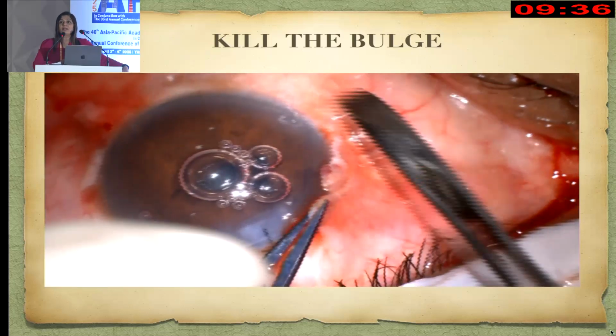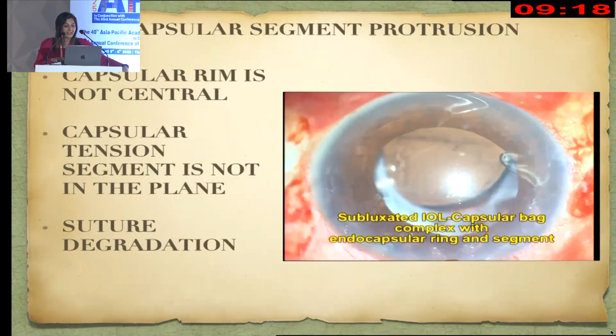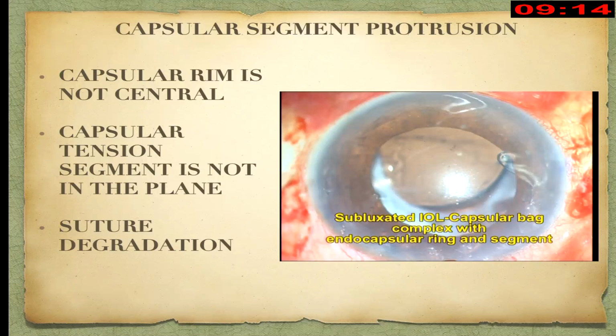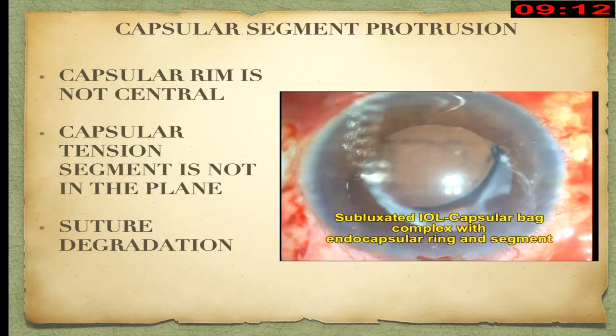Scleral flaps were made for this case initially because we were not sure if the lens would decenter and we might have to do a glued IOL. But nothing had to be done for this case, and the flaps were just sealed because they were made anticipating that there might be some problem during the surgery. But it actually did not happen. I think we're running short of time, so I'll just show this small clip which I want everybody to emphasize.